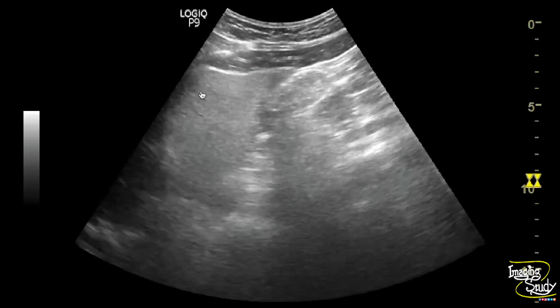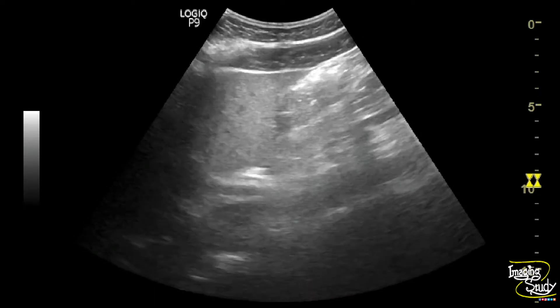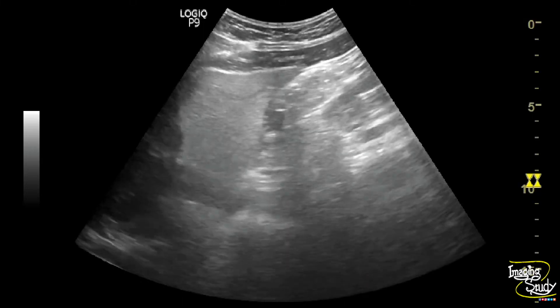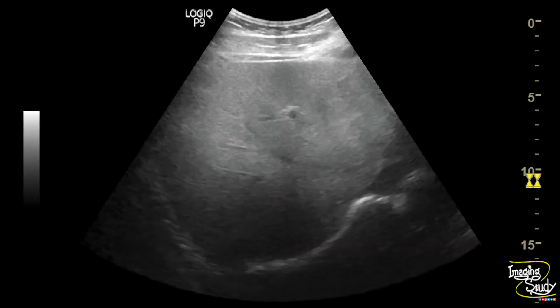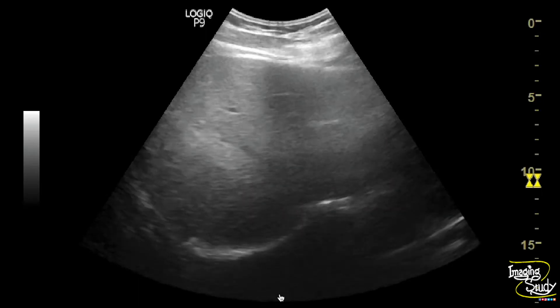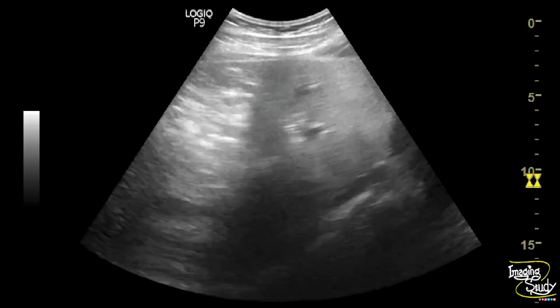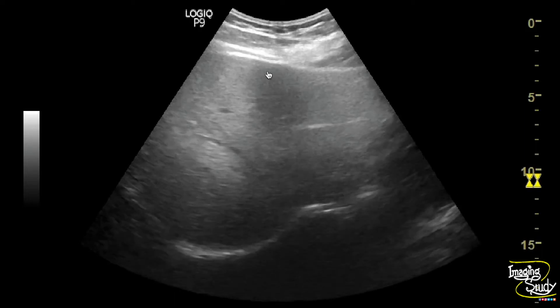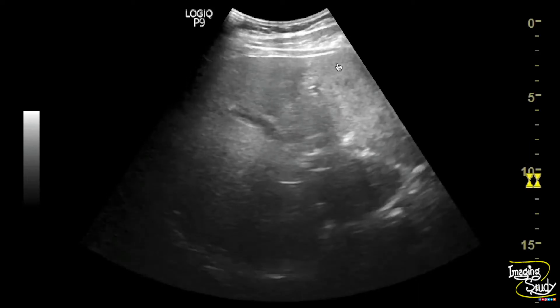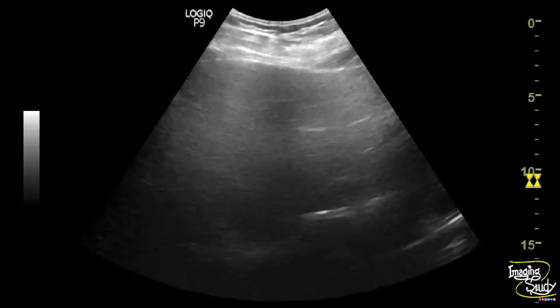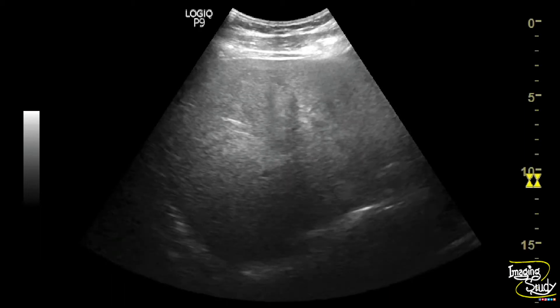Here you can see the left lobe of the liver — it looks quite hyperechoic with distal sound attenuation. Here you can see the right lobe of the liver showing homogeneously increased echogenicity. The vessels and diaphragm are well visualized. You can see the part proximal to the transducer surface looks brighter than the distal part. This condition is due to sound attenuation by the fatty tissue, which is the feature indicating diffuse hepatic steatosis.